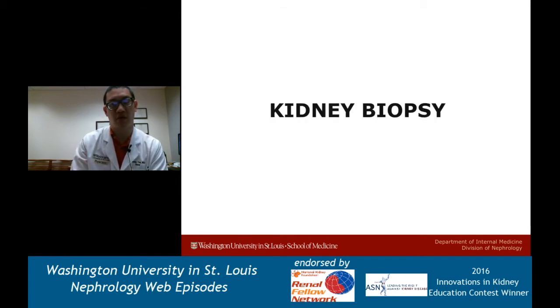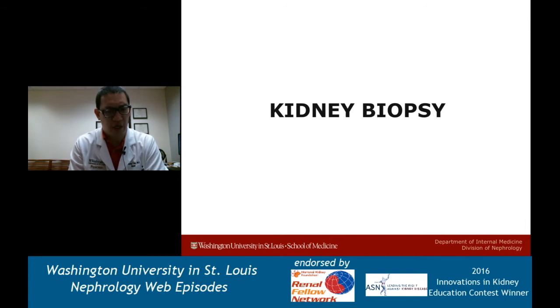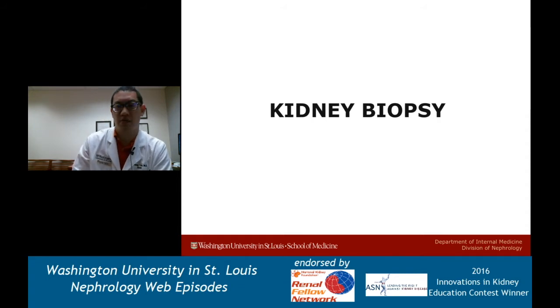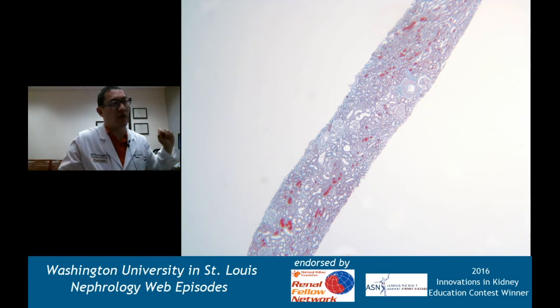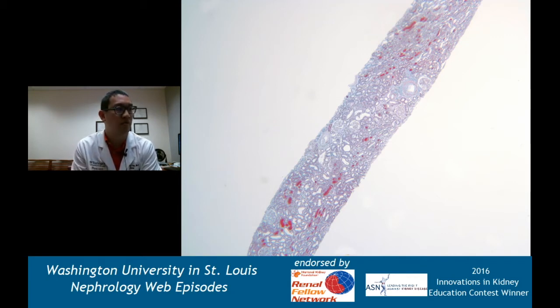This is another good opportunity to pause and think: what do we expect to see on kidney biopsy? We have a positive ANCA, pulmonary symptoms, and microscopic hemorrhage with preserved renal function. This first image is a trichrome stain. She has a good sample - obviously kidney. At this low power, you can't really comment on the glomeruli, but what you do see are red cell casts within the tubular lumen, and those are pretty evident throughout the entire sample.